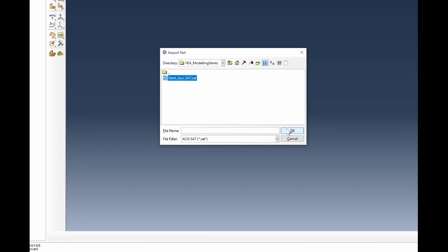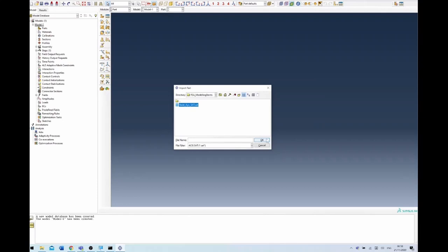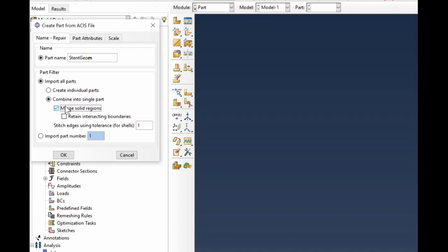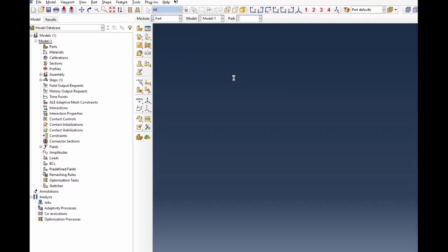If you click on the SAT file, it will give you the option to import the model into your workspace. I select that and click OK. I'm going to change the file name to 'stent geometry.' I'm going to import all the parts, combine into a single part and merge every solid section. If you don't do this, Abacus will break up the part into individual components and it can be difficult to manage. So the best thing is to merge all solid sections. I'll remove the intersecting boundaries because I want clean edges on the boundary of the stent. Click OK - this will then import the model.